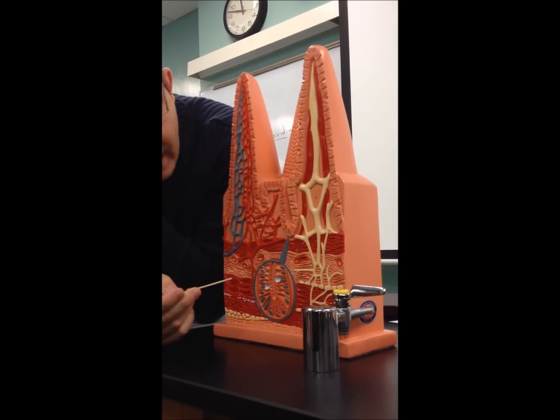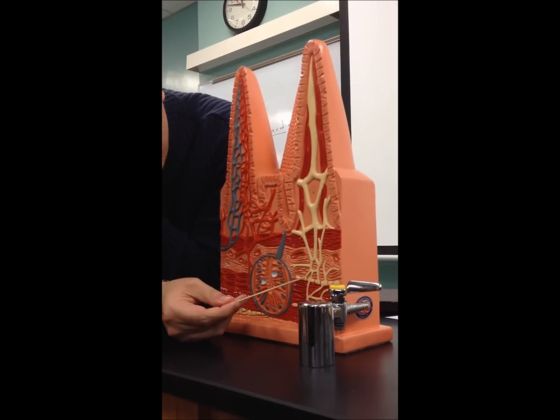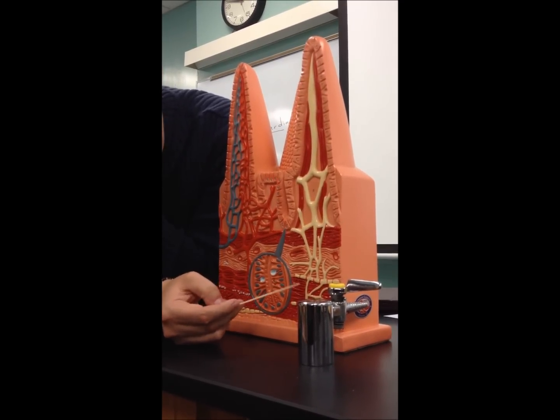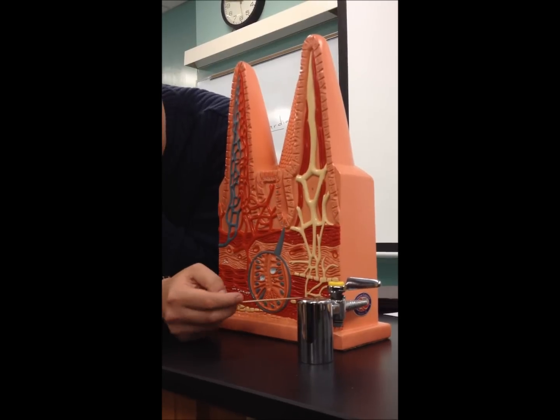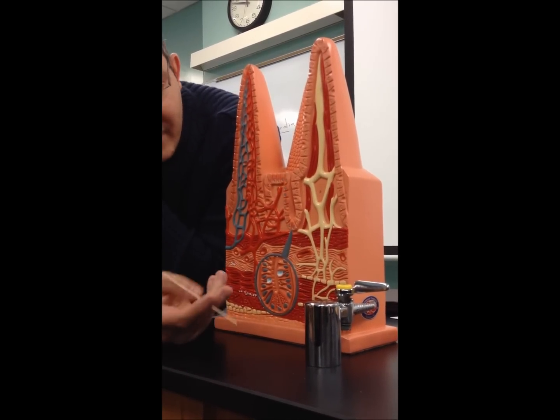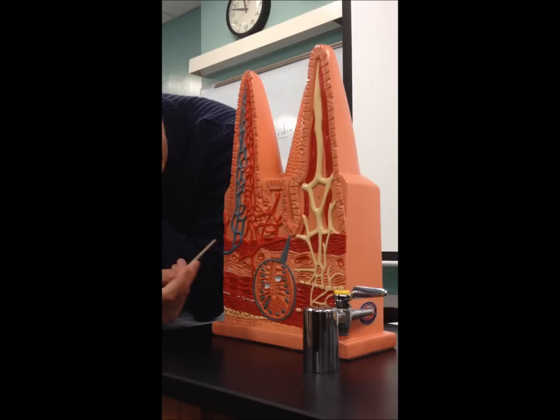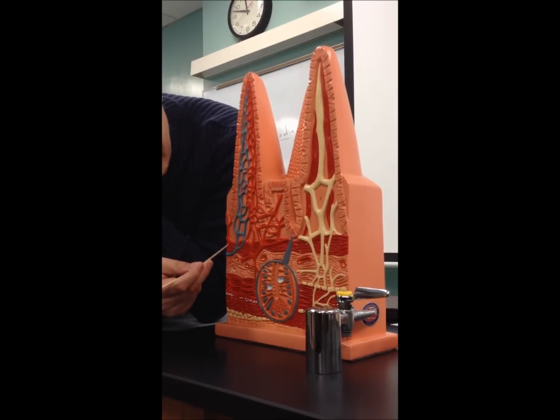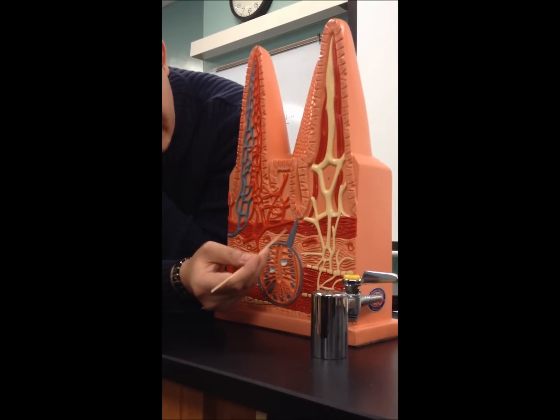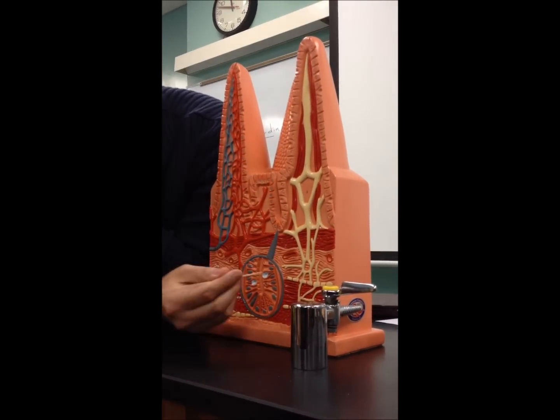And the lymphatic vessels attach to lymphatic follicles. Right there, we have lymphatic follicles. All these are lymphatic follicles, so in all the layers you have lymphatic follicles. And don't forget, this is the lamina propria. Under the lamina propria you have the muscularis mucosa, the muscle layer of the mucosa. Under that you're going to have the submucosa.